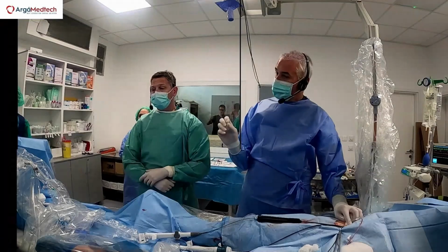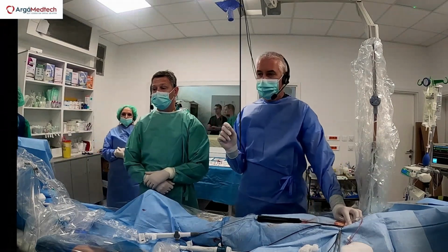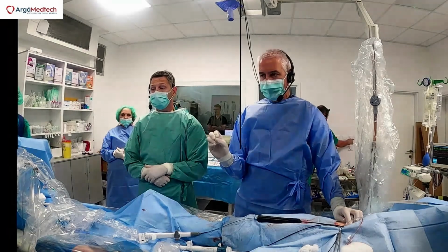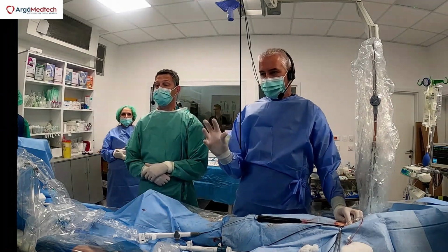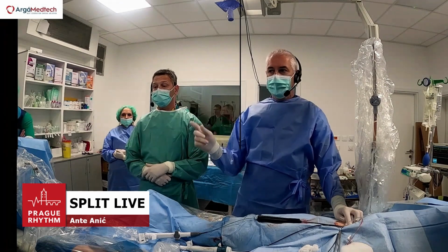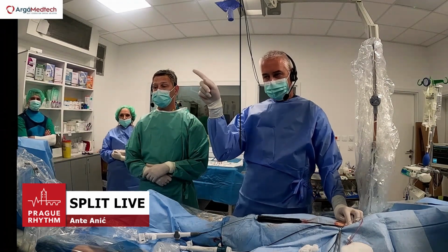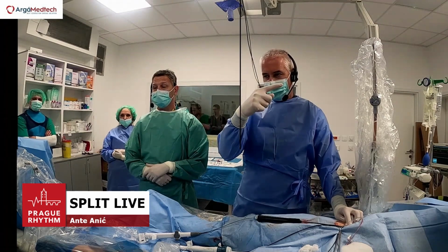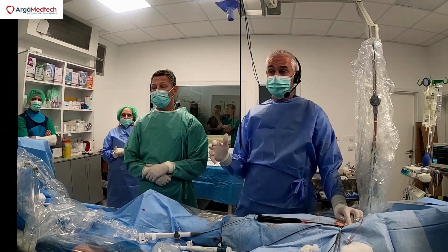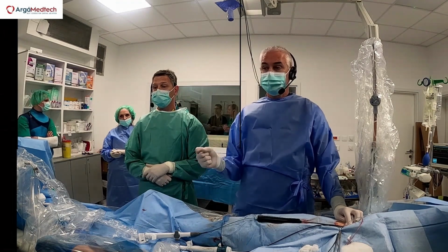Yeah, so here you saw several applications. First off, for the PVI, we use mostly the 8-electrode standard nominal dose. The nominal dose takes 13 seconds, and the depth you get is around 6 millimeters. We applied 2 applications in the roof line, one anchored in LSPV, one anchored in RSPV, with 4-electrode Max. That takes around 24, 25 seconds to apply, but that gives you close to 1 centimeter depth.